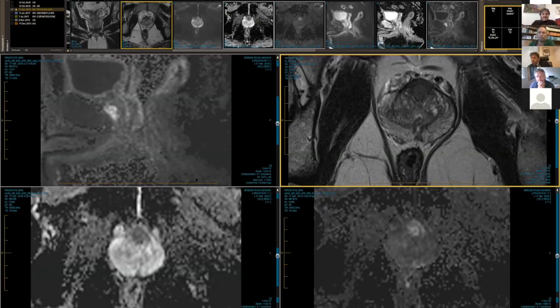And again, we train our trainees in doing prostate biopsy, especially focusing on the parallelism of the probe and the needle, working on this point that is the crucial point of the transperineal biopsy. And especially in anterior biopsy, we find a great advantage of transperineal over transrectal, using sometimes a 2-point access on the perineal skin. But when we have a big prostate, sometimes we move more anterior on the perineal skin to do a 4-access point technique. Yeah. This is especially important for anterior lesion.